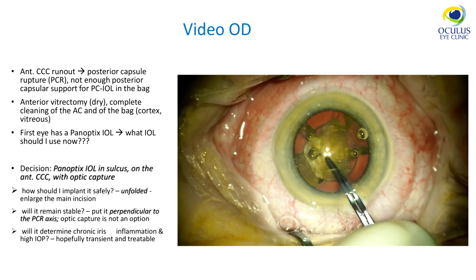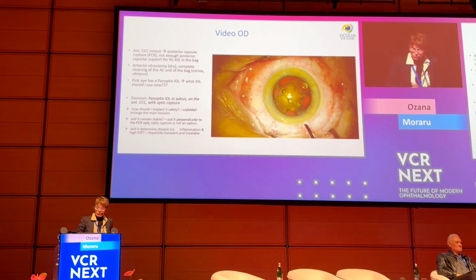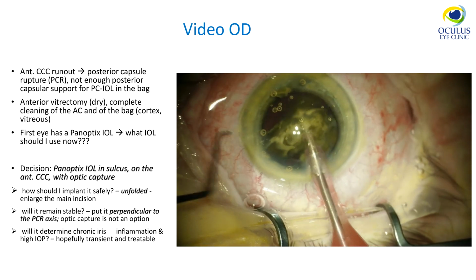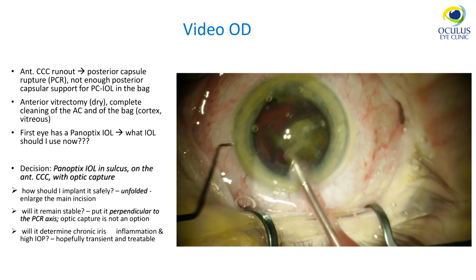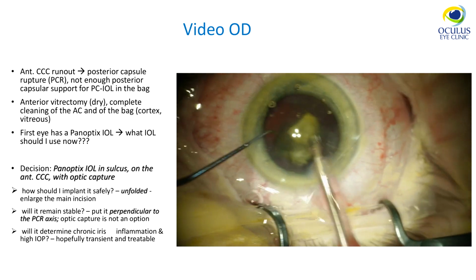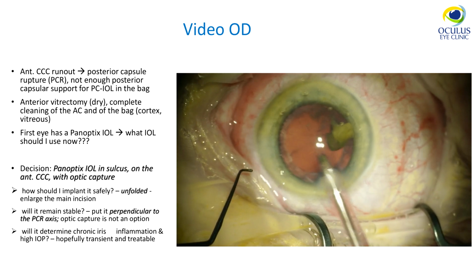Please, if you can start with the video for me, please. So this was a nuclear cataract. The femto part of surgery went pretty much well. I didn't notice anything out of order. The phaco itself went okay, quite a hard nucleus, but I managed to do it very well. I had 8 radial pieces of nucleus, and everything was fine. I'm working on a 2.2 incision, is my standard technique, on the steepest axis, especially in presbyopic lenses.